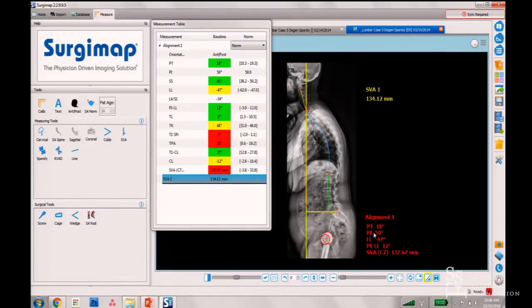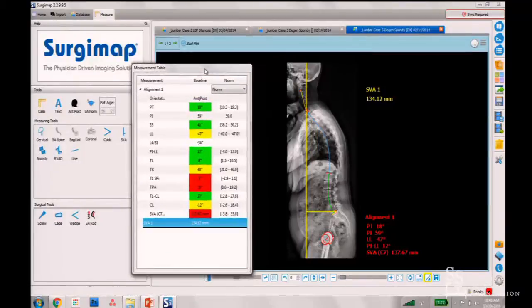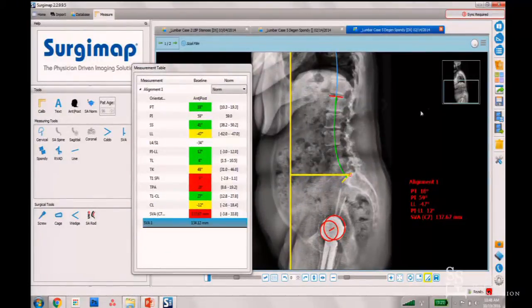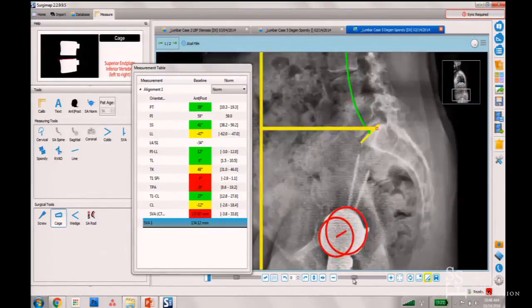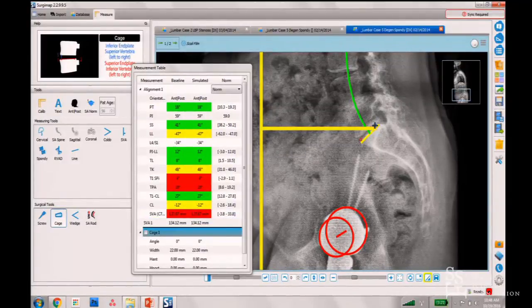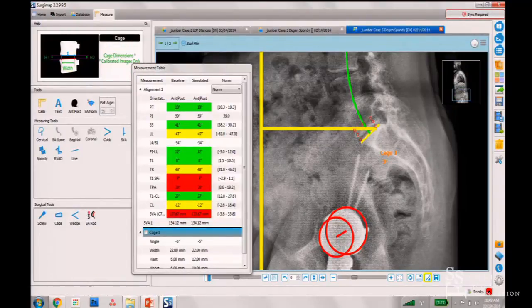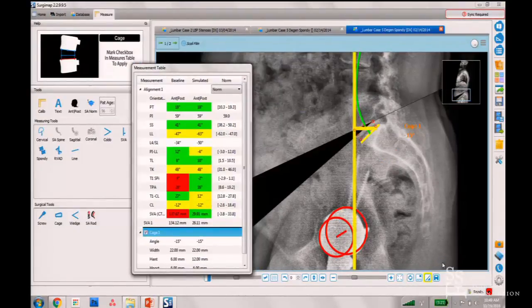Looking at what's going on with this patient, there is a small loss of lumbar lordosis — about 12 degrees — despite a thoracic kyphosis on the larger end. If this patient were a surgical candidate, decided by clinical judgment, you can simulate the surgery. You can decide to increase lordosis through a cage, draw the cage, apply it, and see the change both on the image and in the measurements.